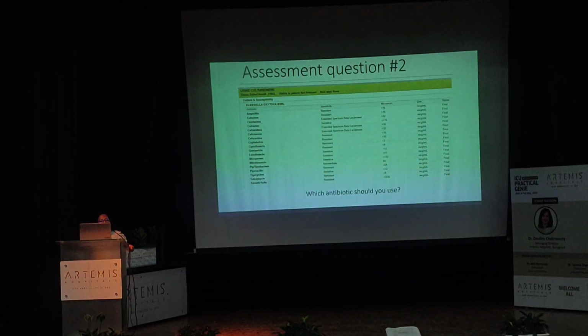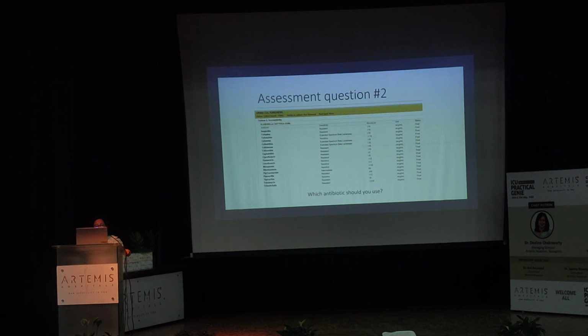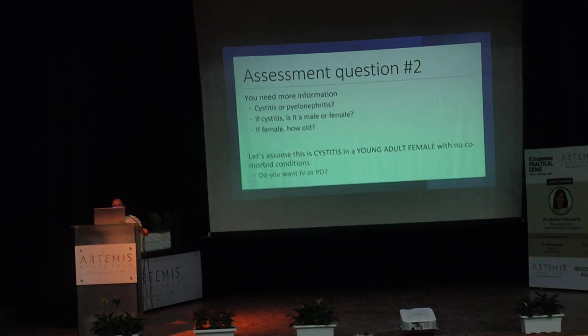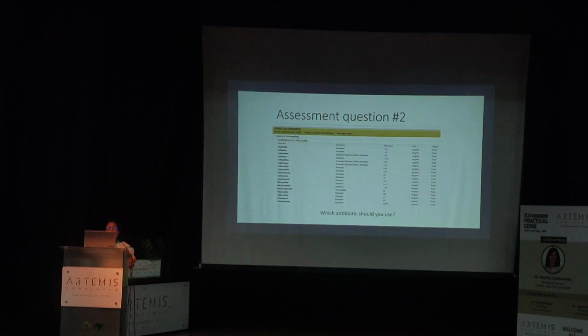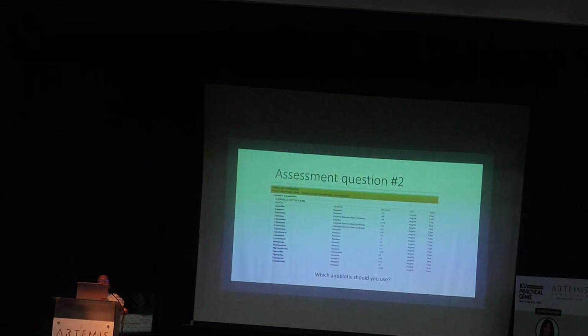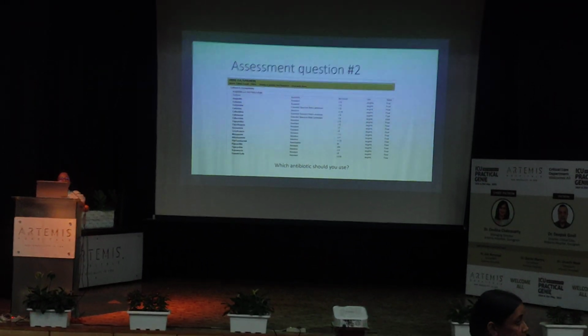So we know that it is an ESBL organism in urine. Accordingly, we will add antibiotics. But some laboratories are not testing ESBL. Then how will you determine whether this organism is an extended spectrum beta lactamase producer or not? This is a very important question, because not all labs test ESBL. Anyone would like to attempt?